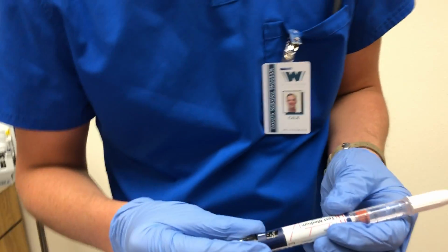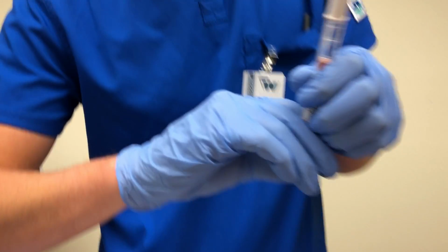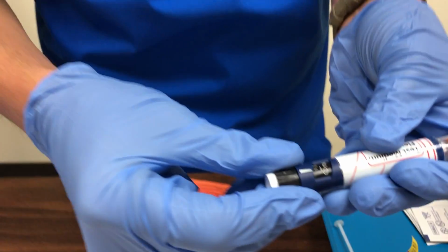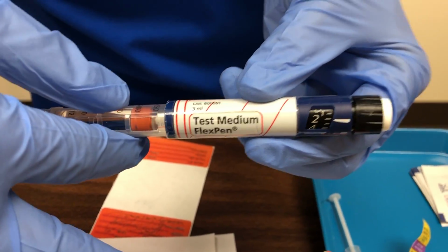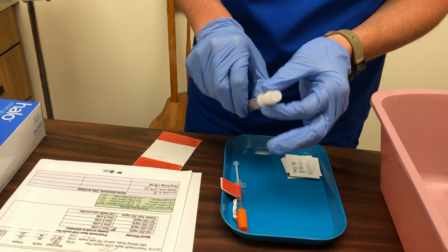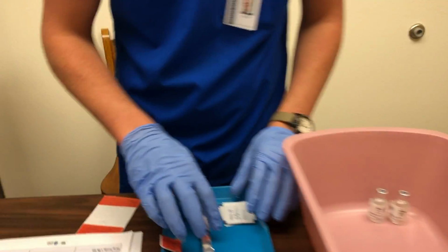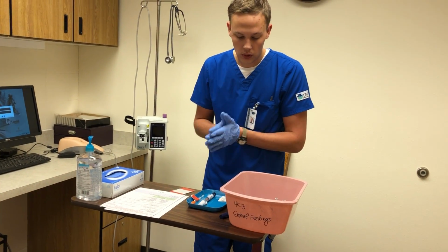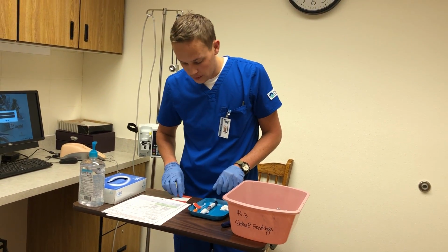Okay. And so then, that wasn't all of it, that was just the one. So there's all 2 of it. So then we're going to go 1, 2. We're at 2. I'll turn it around for you. We can scoop that just to make sure we have a safety on it. Okay. And so with that, we're ready.